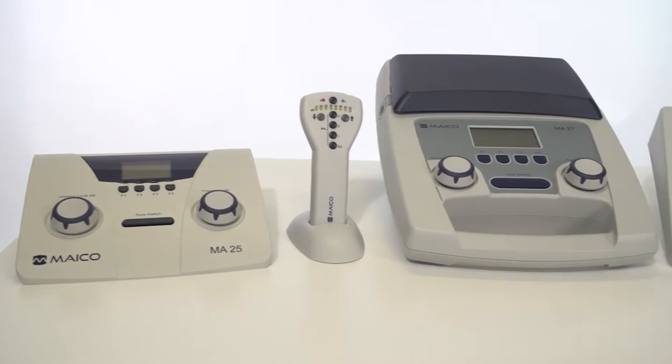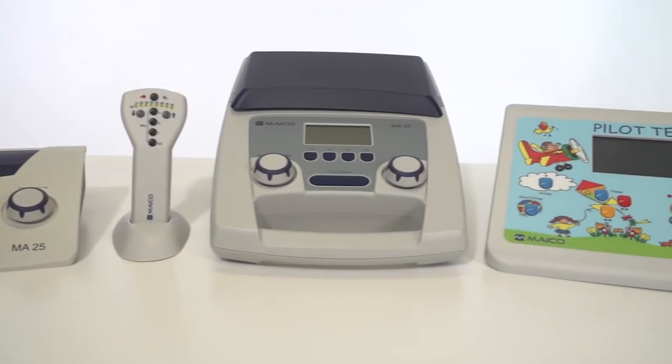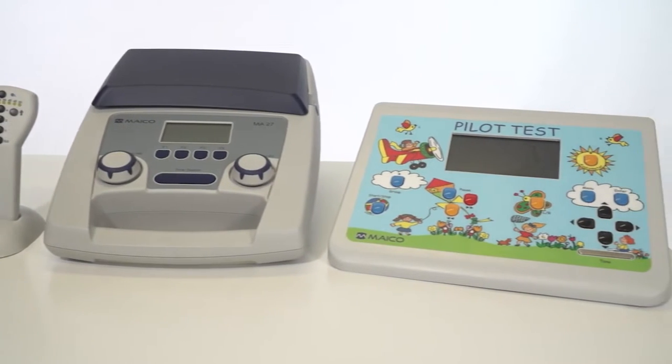Any audiometer can be used to perform a hearing screening. Here are the air conduction screening audiometers available by MAICO.